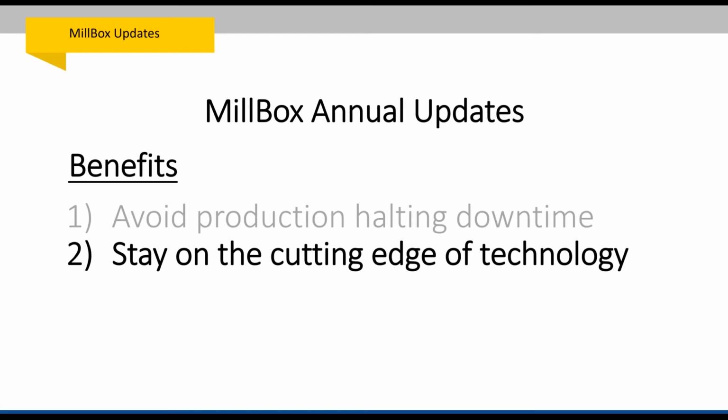So if you want to be trying new things, you want to mill in amber, you want to mill in Emax and some of these newer technologies, you really must stay up to date. And let's face it, if you're not staying up to date, the lab down the road is, and you're falling further and further behind. I don't want to see that happen to you. So please stay current on your annual updates. It's definitely a benefit to you to do that.